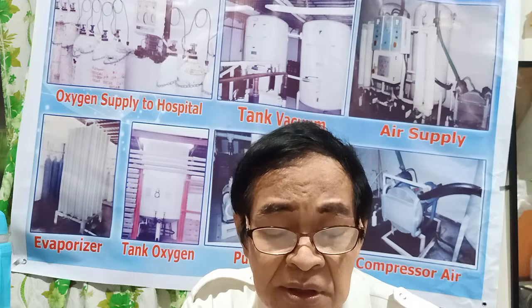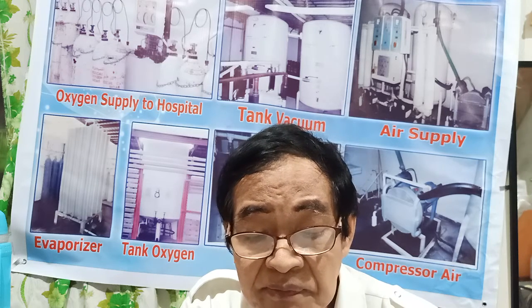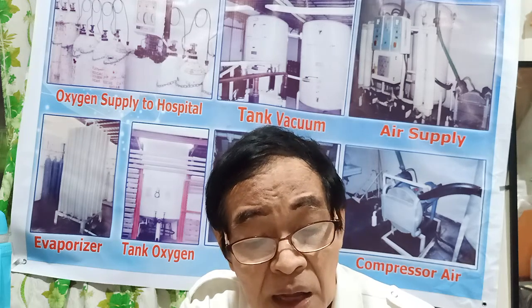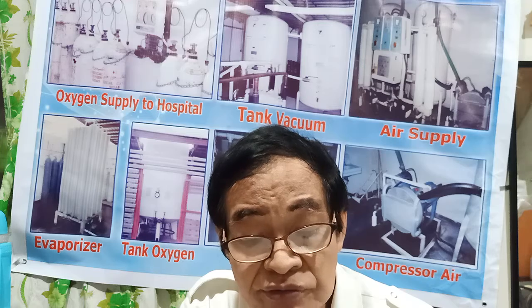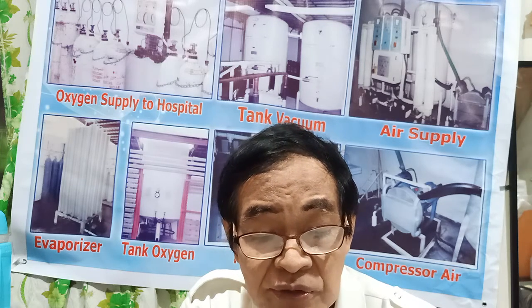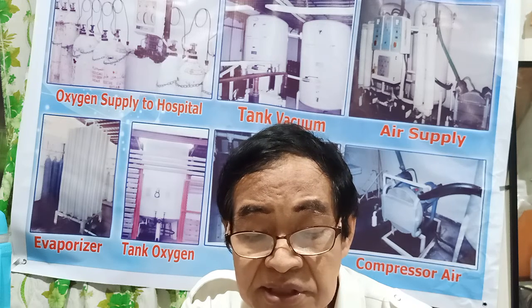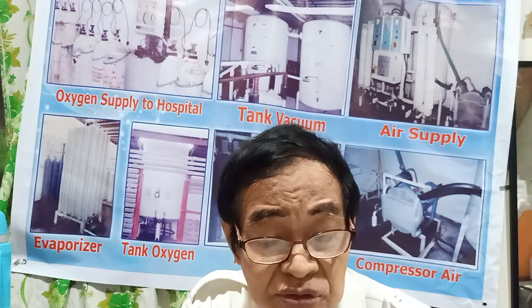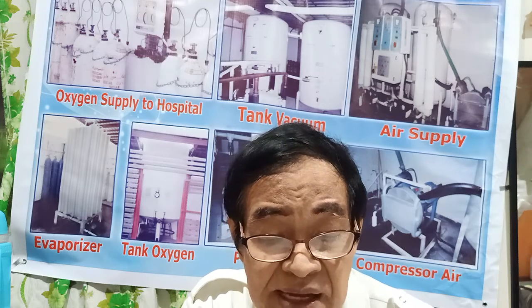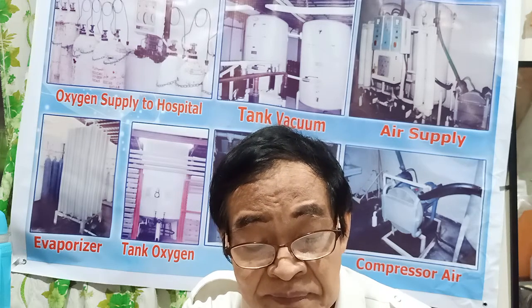Tanks containing oxygen, nitrogen and nitrous oxide must be mounted on a concrete foundation. Installations comprising vacuum jacketed tanks are significantly different from gas bottle installations. Number one, the gas is stored as a liquid, not as gas.